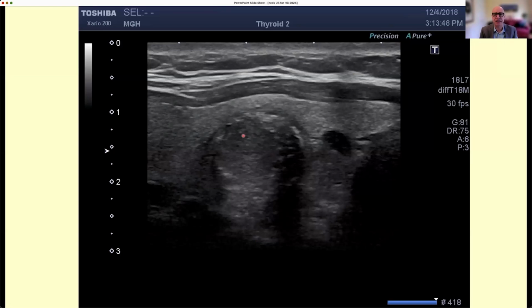Sometimes you have calcifications that are not continuous. We call them fractured, and they're considered to be a little more dangerous. And you can see here that there is some shadowing. You can see that some ultrasound image is being generated. There are some calcifications here, but it's not continuous. You can see that this is what we call fractured calcification. Again, fairly easy to identify, mostly because you'll find some shadowing almost always in these calcifications that are large enough not to allow for any scattering from the probe to be reflected back and mask the shadow.